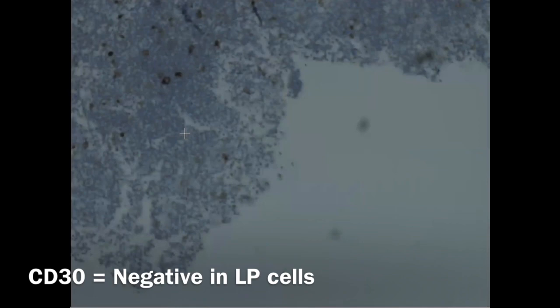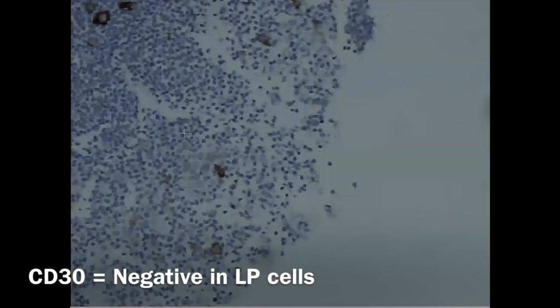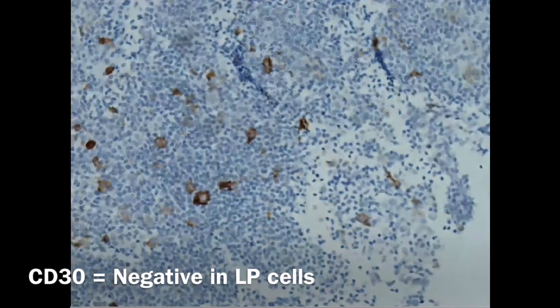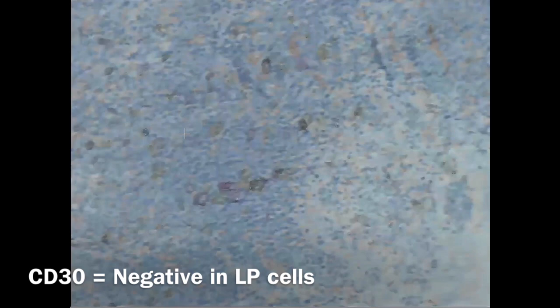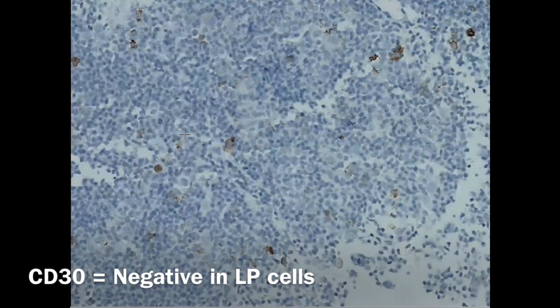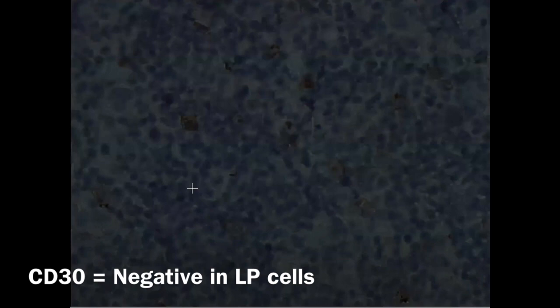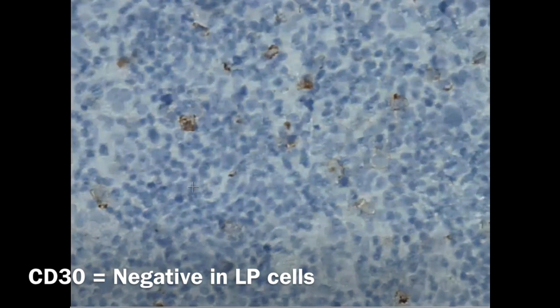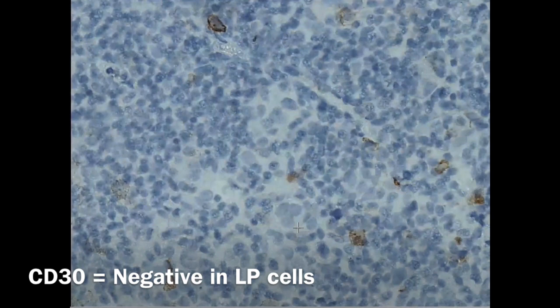At higher magnification, those cells taking the stain can be immunoblasts, but they are not the LP cells. I will show you the LP cells here. This is a big cell and from my microscope it looks like a popcorn cell, and it's not taking the CD30. On the 40x, here is another LP cell and it's really negative.